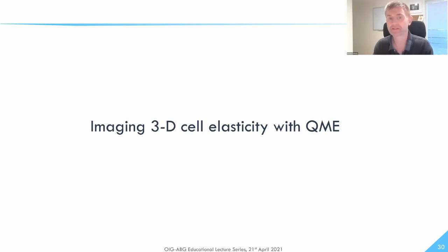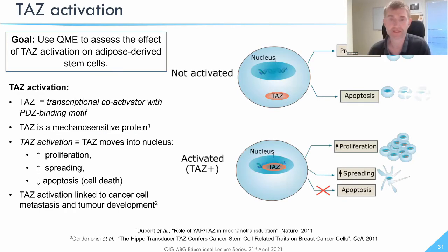So in the last few slides, I wanted to talk about applying this technique to scanning on the cellular scale. And really I'll show results from a system with about 5 micrometers resolution optically, but we've developed a system that has sub-micrometer resolution as well, which we think will greatly increase the ability to see not only cellular scale, but actually intracellular components, intracellular elasticity.